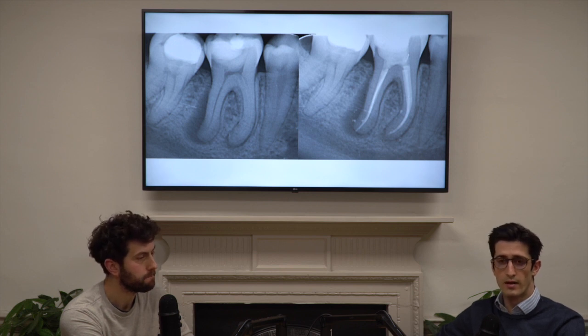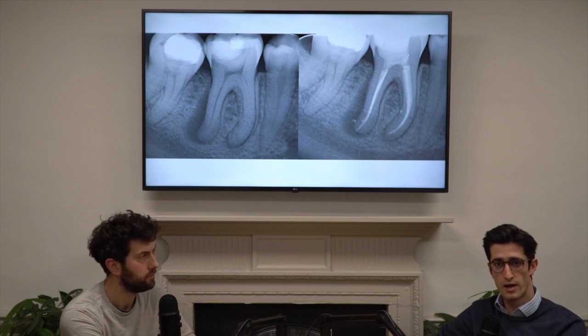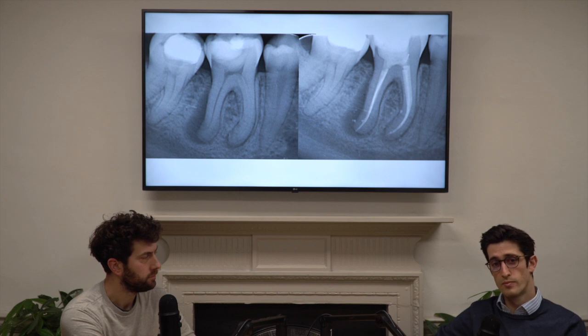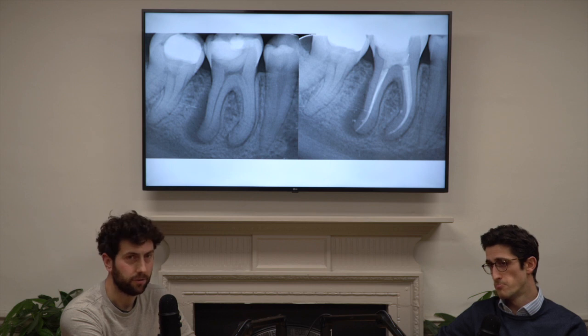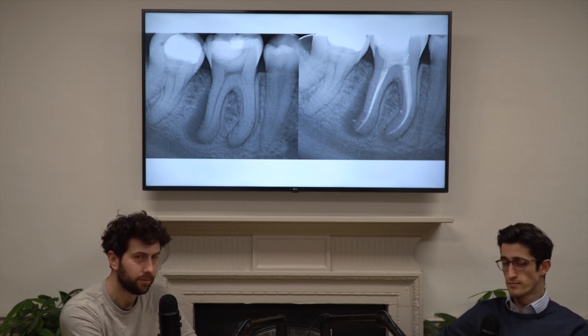So once I've done my orifice opening, I take my 10 further, and in this case, it reached the apex. And then I take my WaveOne Gold glider, my glider file, to my 0 reading. And then my WaveOne Gold primary, my finishing file, to 0.5 millimeter short of that. It's a simple technique, isn't it? 10, glider, shaper, done.